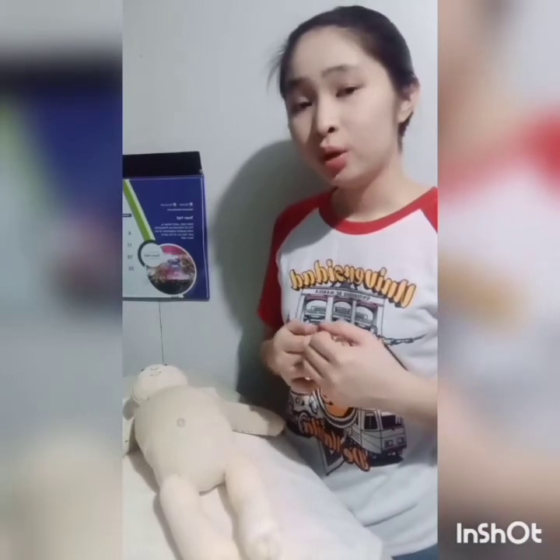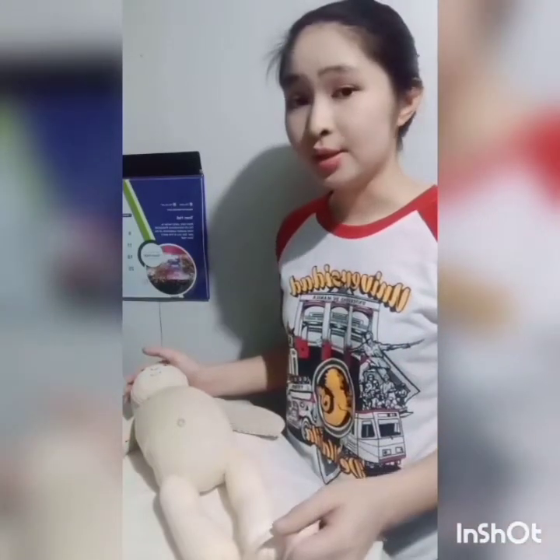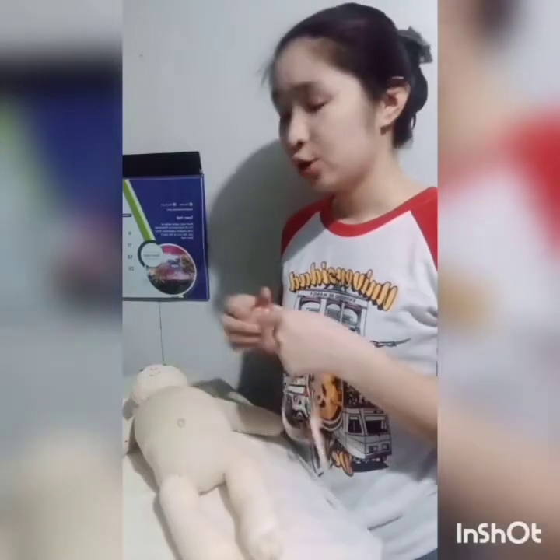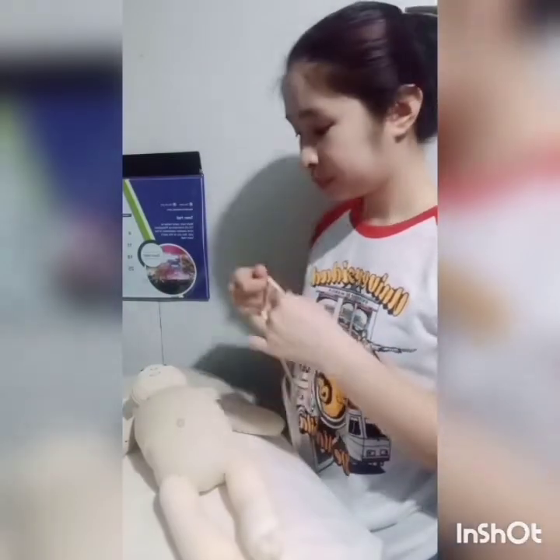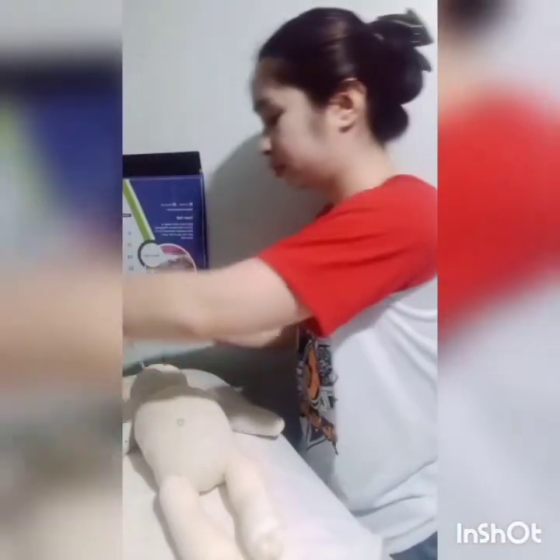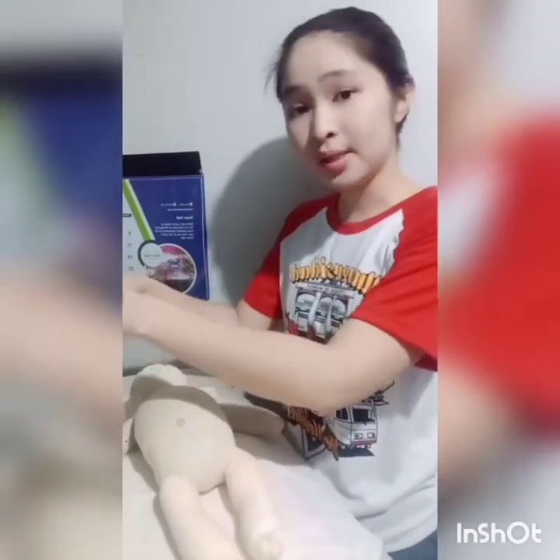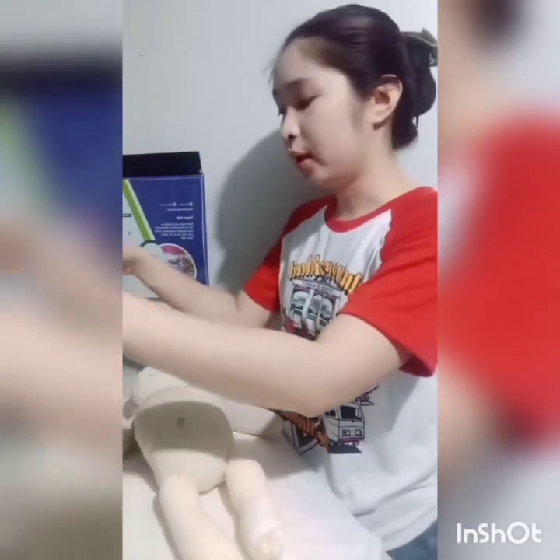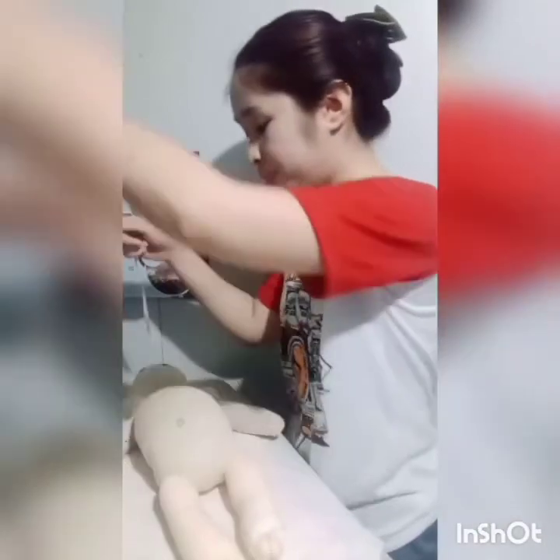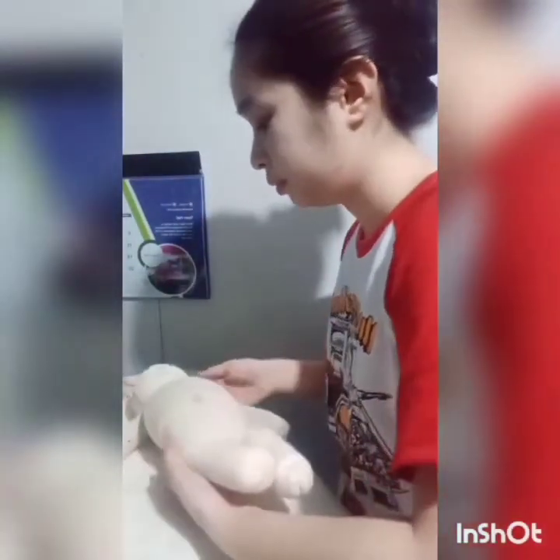So now we are going to move forward in measuring the baby's body circumference, starting from their head. Still measuring the baby's head, we're still using a tape measure. So I will just position the baby near the camera.